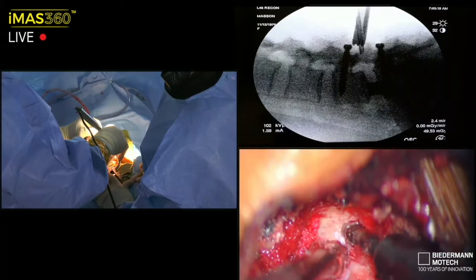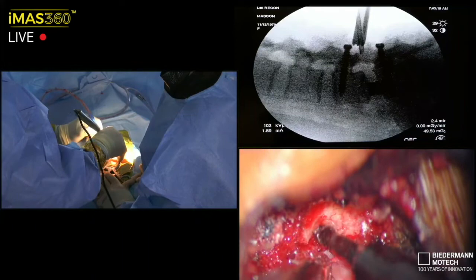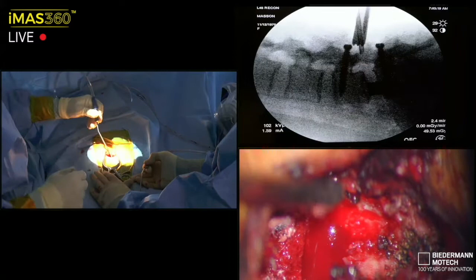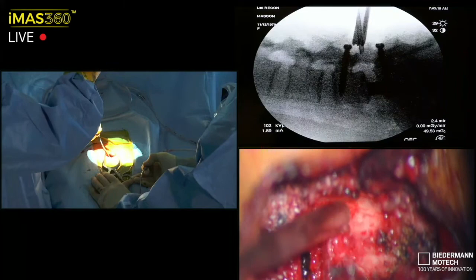Okay, so we're just getting our dorsal exposure superiorly, all the way to the ligament here, the internal cortical bone. That's going to set us up for that internal laminectomy and broad dural exposure. All right, so here we go. Let's get our focus in play.